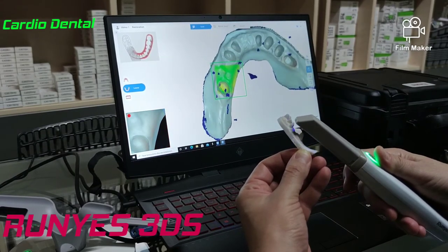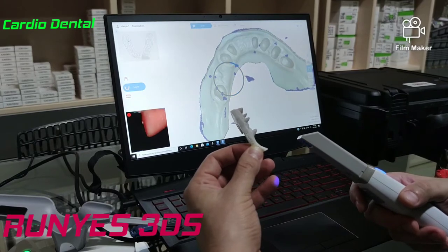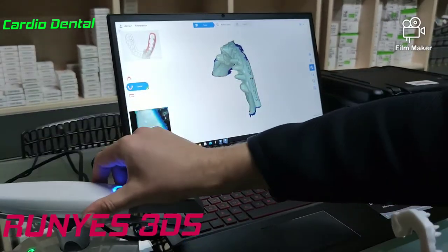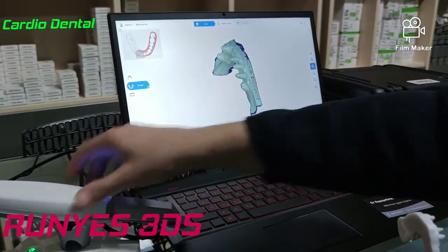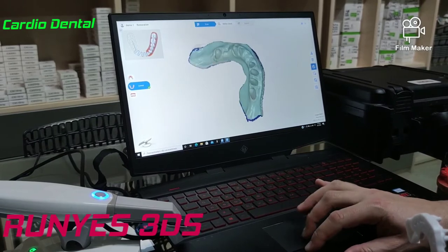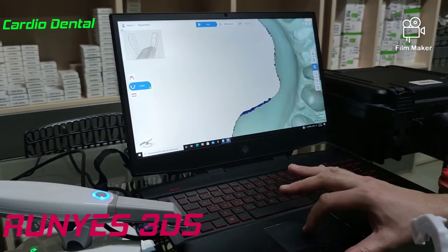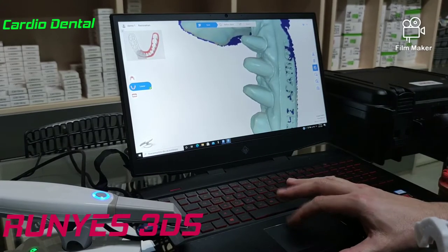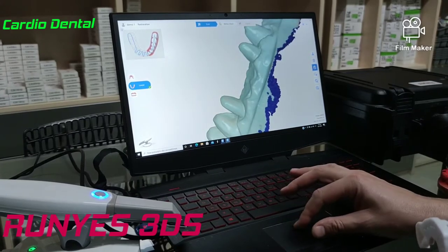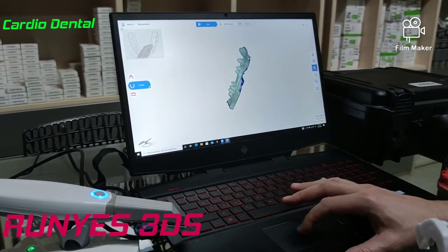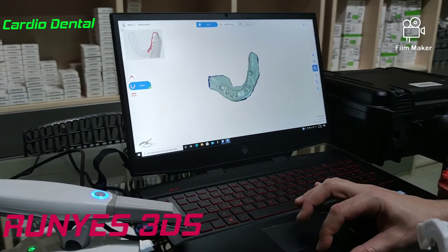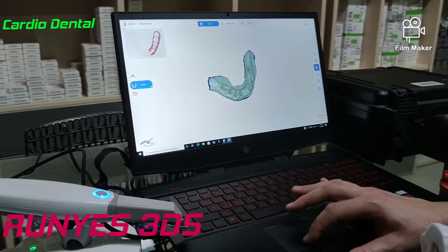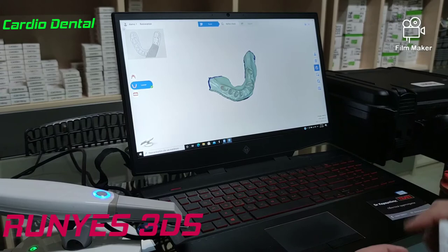The other blue spots are noise — from clothing, the tongue of the patient, or other objects. A very important thing that differentiates this from other scanners is that we don't have to scan the teeth separately. We have just one scan, and the scan is so clear that we don't need to scan anything else. This is the lower jaw — scanned in one minute and twenty seconds, with all the details, no gaps. Everything is perfect.